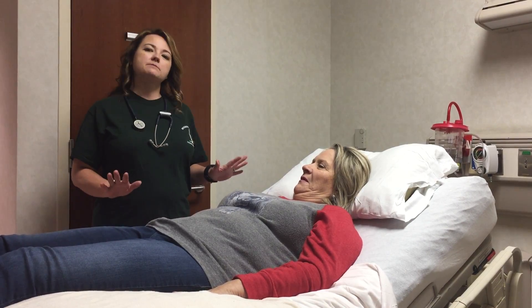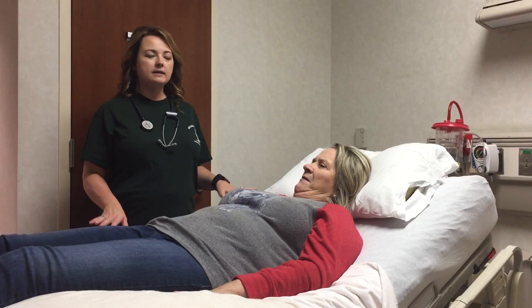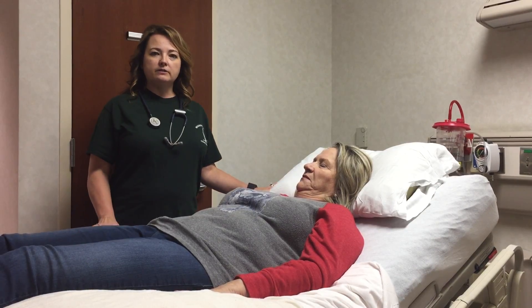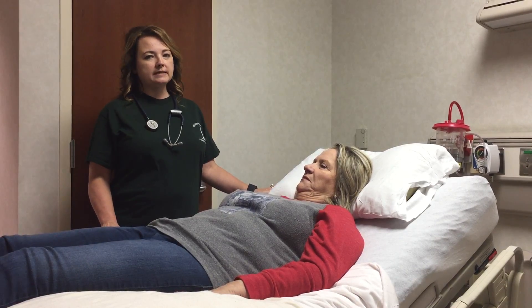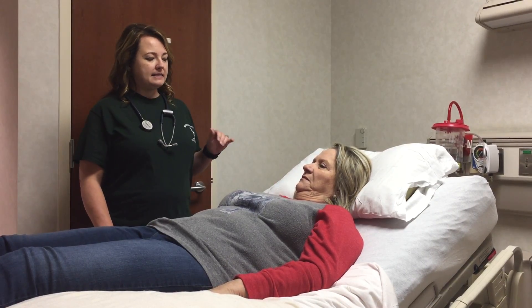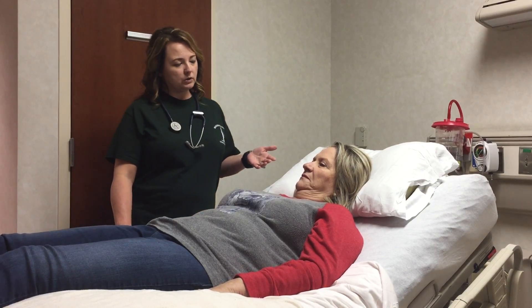I'll begin my assessment by standing on the patient's right side. The head of the bed needs to be at 30 to 45 degrees. I'm going to begin by assessing the jugular pulses.